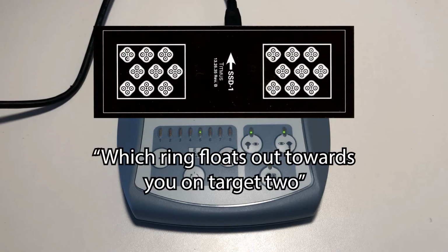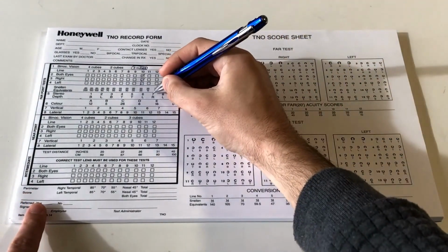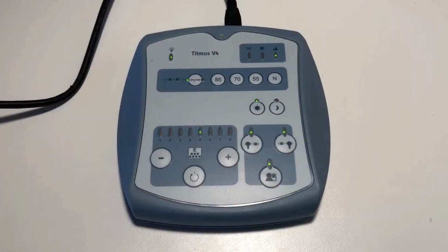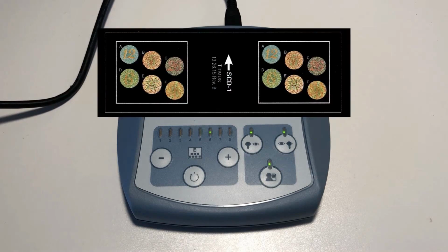If yes, say to the patient, tell me which ring floats out towards you in target 2. Repeat for all 9 targets and record the last correct answer given by the patient. Advance to slide number 6. This slide tests for red-green color perception.